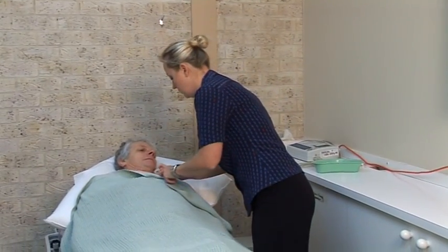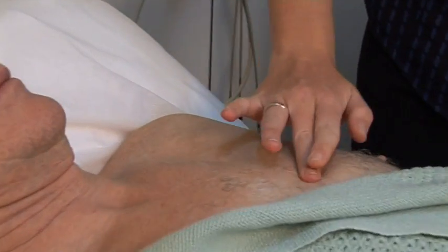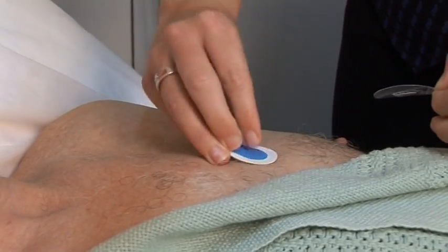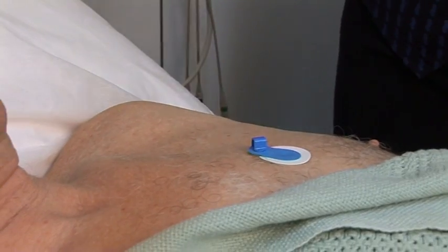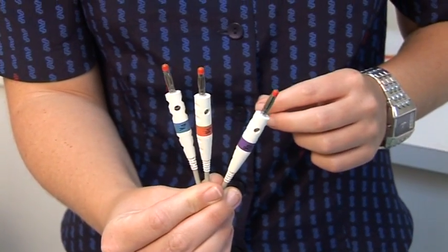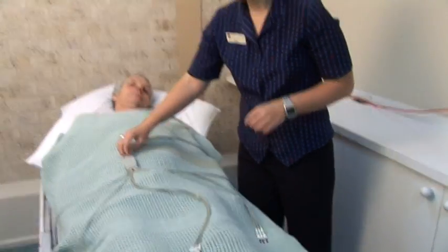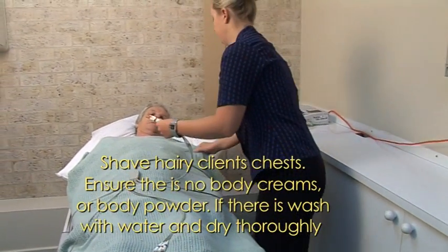Explain to the patient that the procedure will not take long and it will not hurt. They must refrain from talking and moving whilst the recording is taking place. And it is imperative that the electrodes are placed in the correct positions and the leads on the correct electrodes. Skin preparation is also vitally important. Shave hairy patients and remove any powder or skin creams with soap and water only.